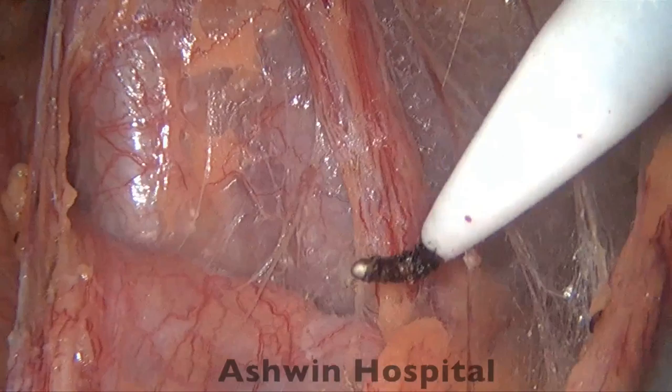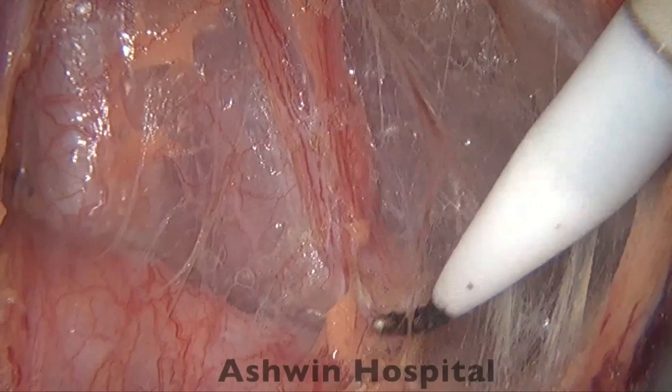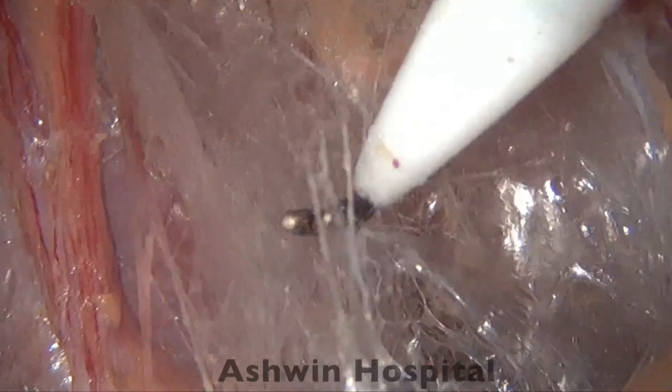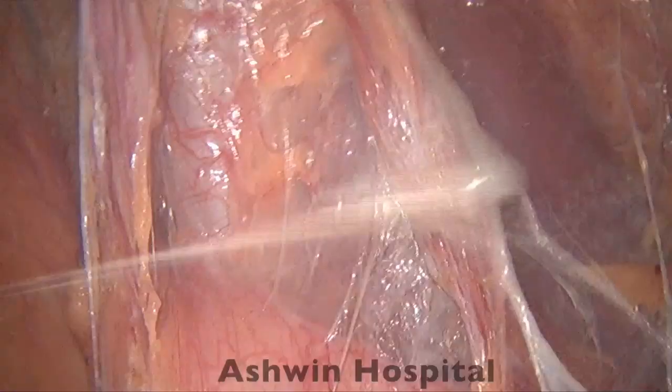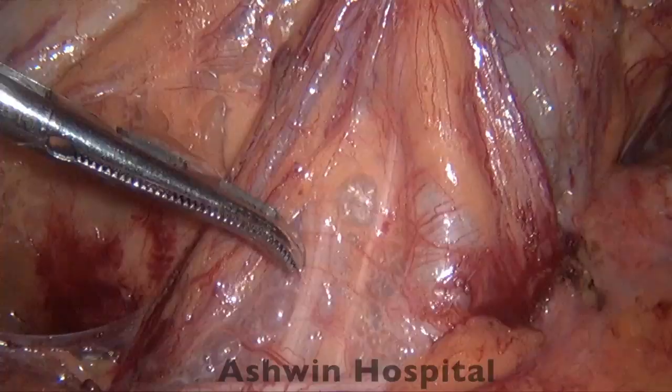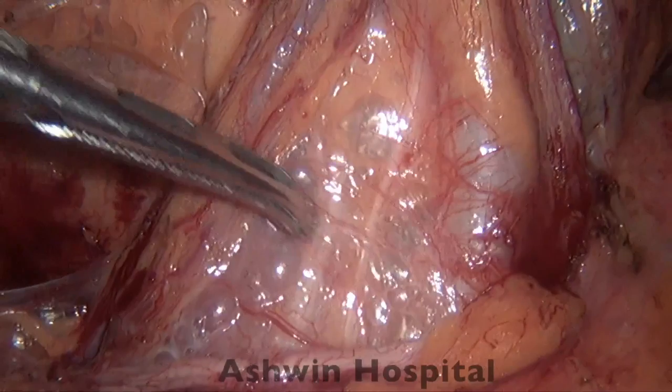You can see a nice fascia which is covering the nerves. That makes sure that the mesh doesn't come in contact with the nerves in a bare manner, and you have some protection so that we don't have any chronic pain in the postoperative period. So again, this loose areolar tissue which is present is dissected. So these are the nerves with the fascia on the left side.